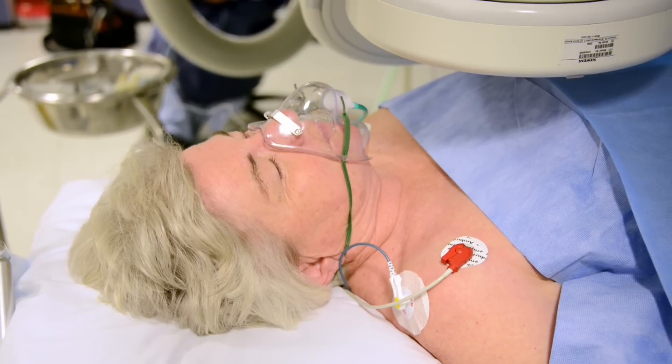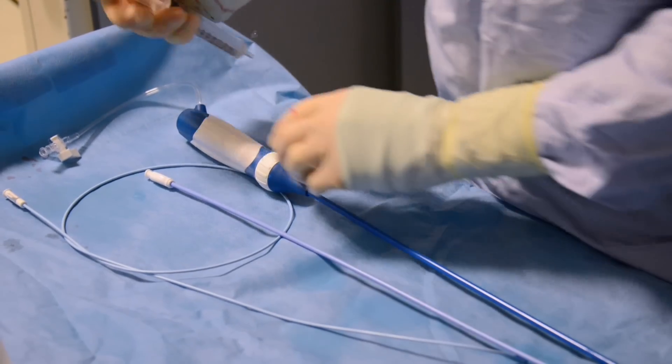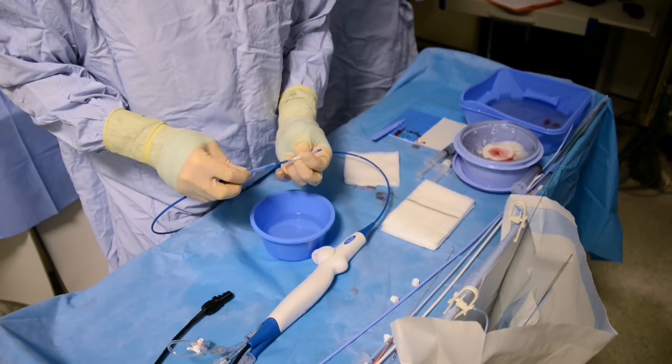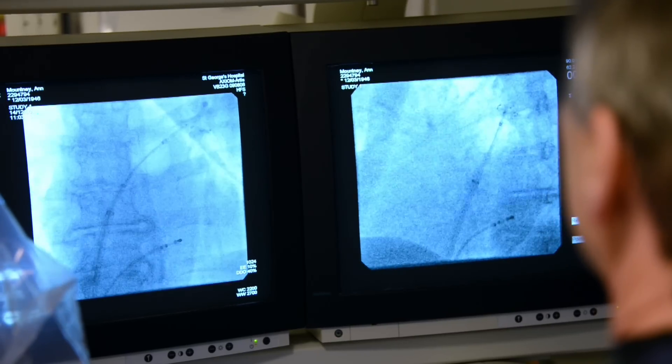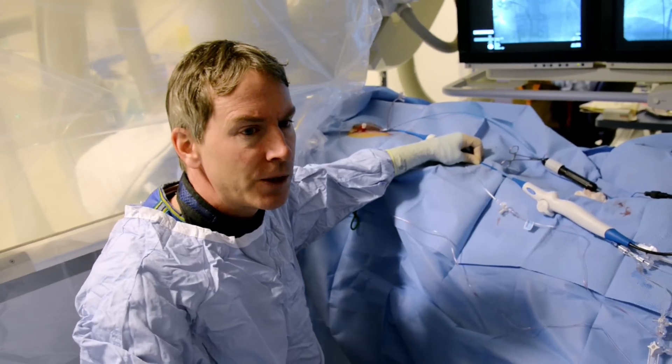This procedure can be done either under general anaesthetic or under local anaesthetic. Today we've used local. An ablation typically takes something around two and a half hours. The equipment I'm using here is a cryo balloon — a freezing balloon. So we've just isolated that vein. Using the electrical activity that's causing the problem, we can track down that little bit of tissue. And now we're going to treat the vein by freezing.